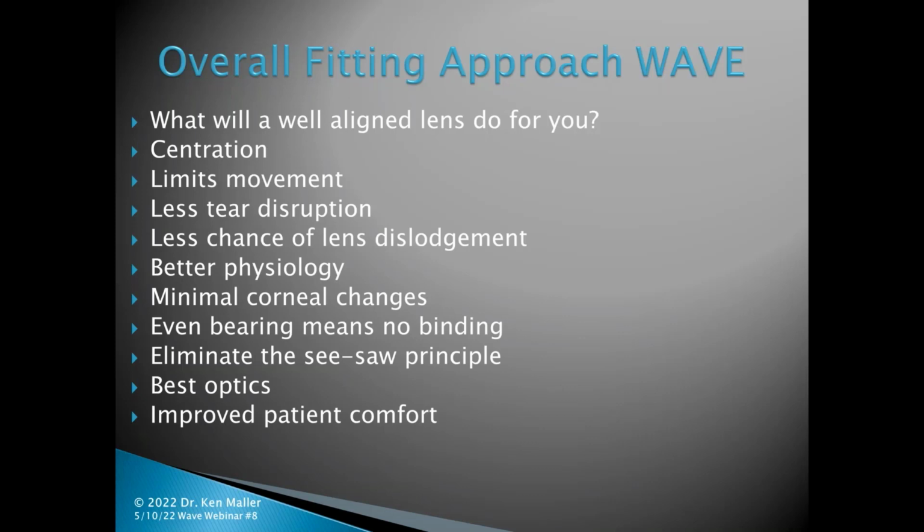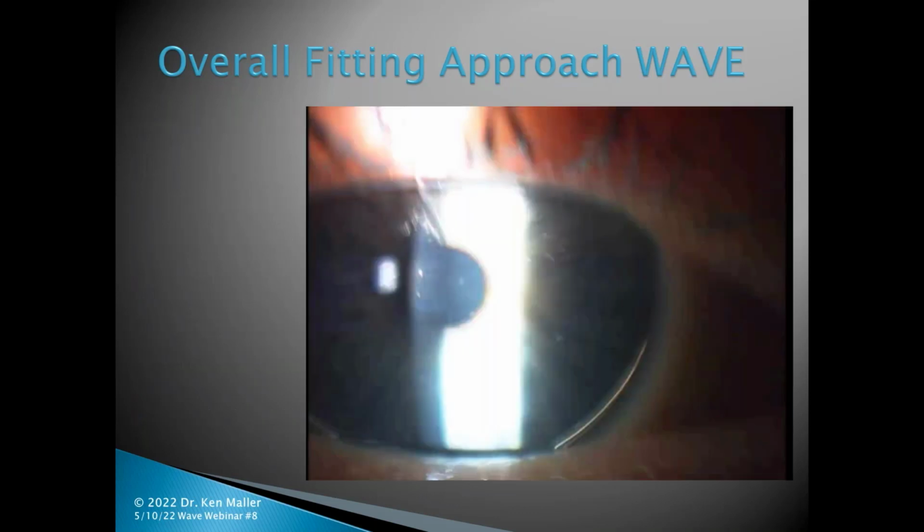Patient comfort, which is the biggie that tends to be pushing GPs down to the list of what would I like to fit this patient into. Absolutely, by getting this lens aligned and getting all of these benefits above, you absolutely will improve the patient's comfort. So let's take a look.